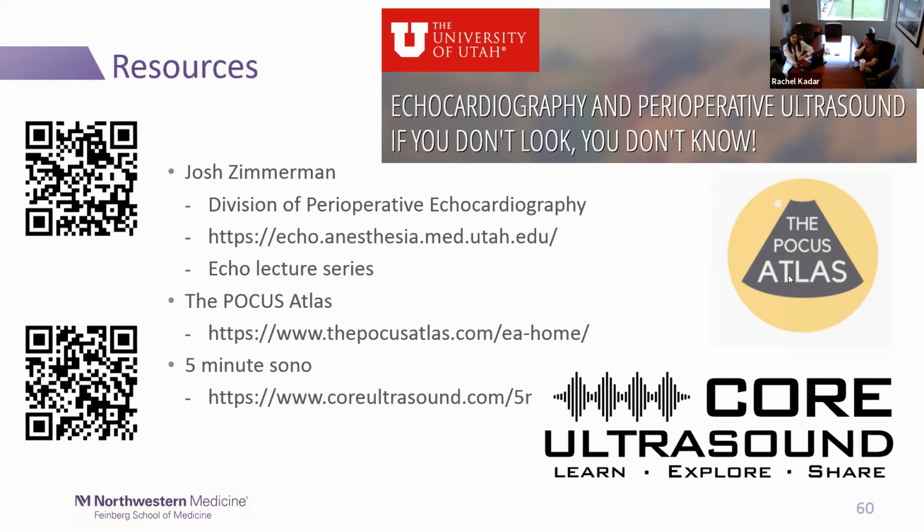The more often you do it, the more you're able to gather information from images that aren't quite as clear. But I always preface that if your image quality isn't good enough to answer the clinical question, get more information and call for that formal echo. Say, I'm not sure if this looks normal, I'm going to call in that stat echo because something is not right here.